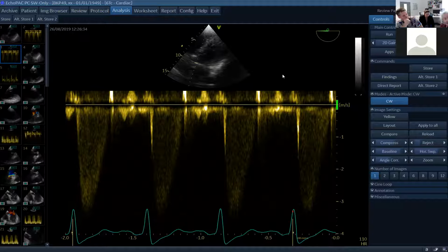Now, if this is an aortic valve replacement, then you expect a degree of increased trans-aortic pressure gradient that is part of the function of a normal valve. However, 3.2 suggests that it may be a little bit more than is expected for this type of valve, and you would have to look it up. Okay, you said it could be obstruction, are there any other causes of a raised gradient?